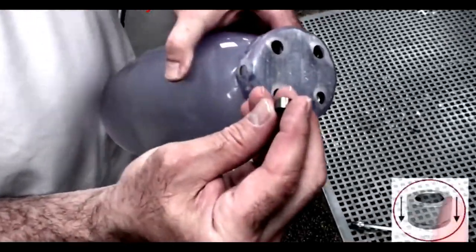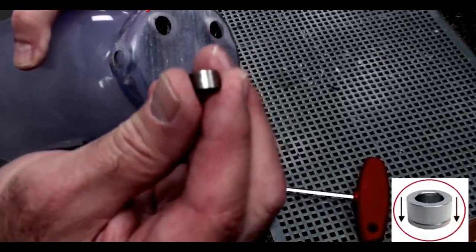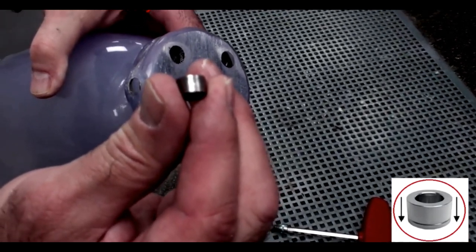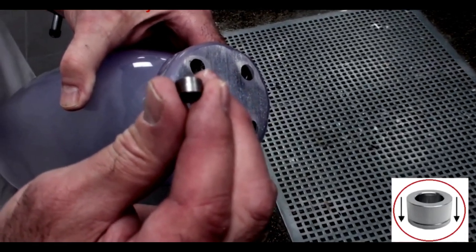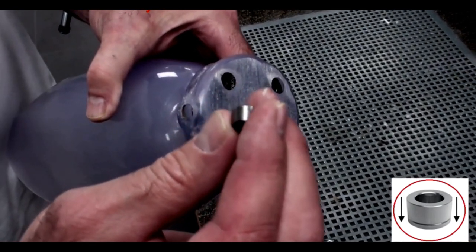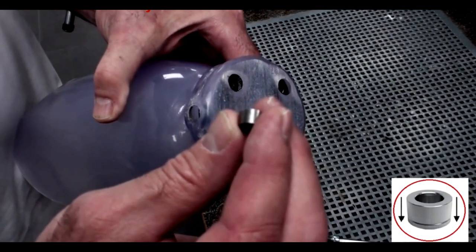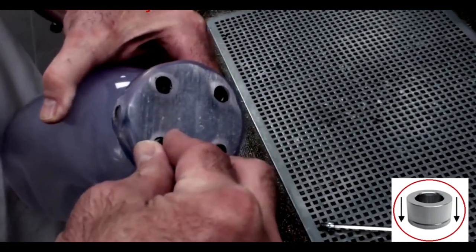Next you'll insert the snap bushings. Notice the ring. You'll apply a silicone bonding agent. The snap bushings are slightly conical, so the slight ring that you see on one end needs to be inserted first. Like this.